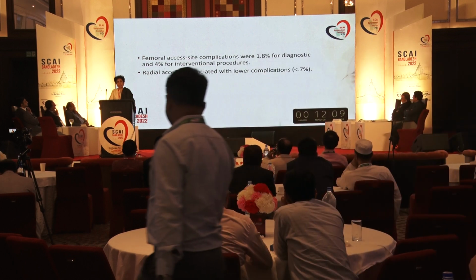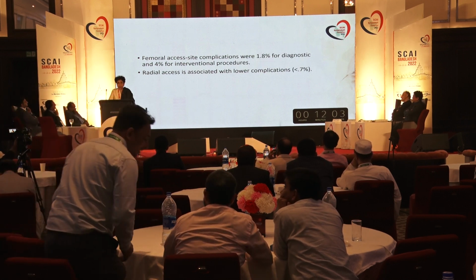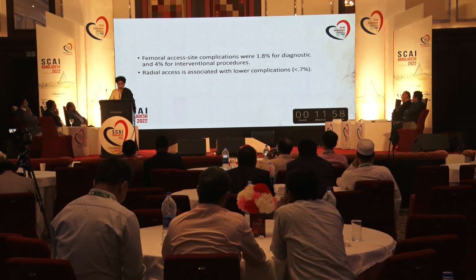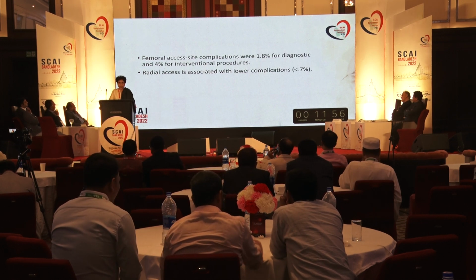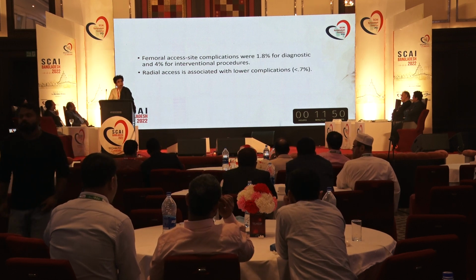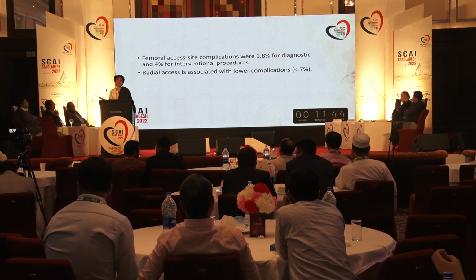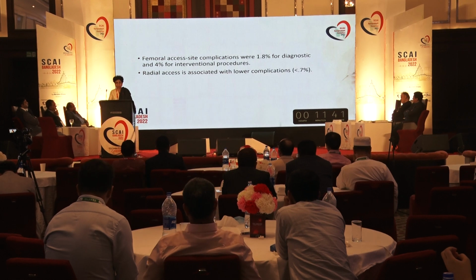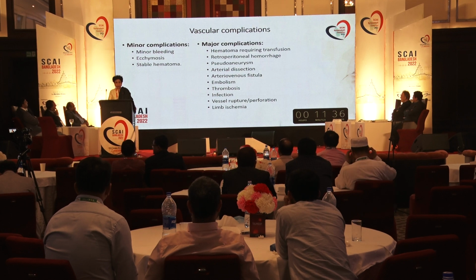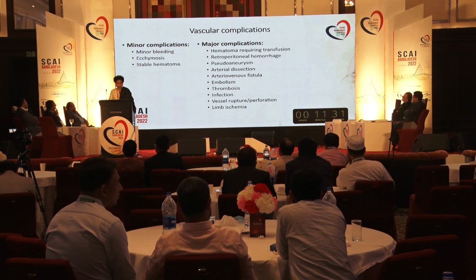Starting from minor complications to major complications, the incidence is around 1.8% for diagnostic procedures, but it is higher for interventional procedures, around 4%, because in interventional procedures, we tend to use heparin and other things like GP2B3 receptor blockers more. And it is true, radial access is associated with lower complications. It is more comfortable for the patient, and obviously it's great to use, but sometimes you do need to use the femoral.